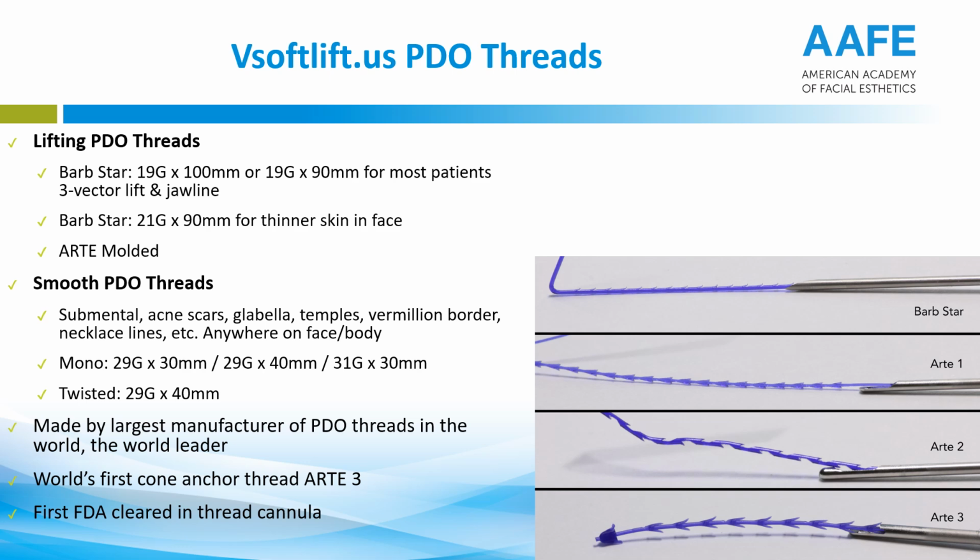They do not have vSoft Lift put out a new thread every year, just like Botox doesn't put out new Botox every year, because when you have the strongest thread with the best collagen biostimulation, that's FDA cleared class 2, known origin and proper packaging, there's no reason to put out a new thread. This works better than anything else that is out there too. So they have a range. You don't need a big range to really go ahead and get this done here.